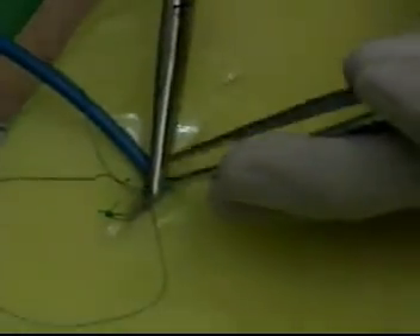After closing the skin, the catheter is fixed with the help of a dressing.